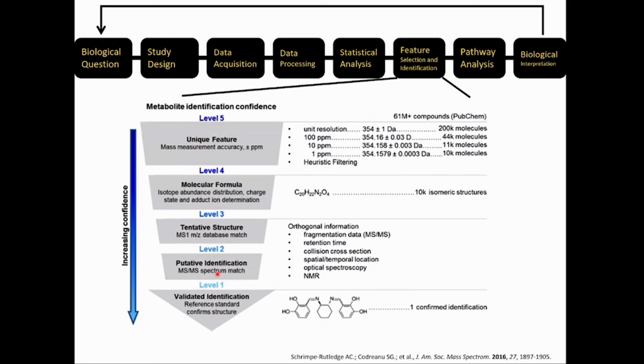I've seen where you can create these fragmentation energies, where you do different fragmentation to look at least at the species of a molecule and track it down. Exactly, when you're not getting a hit. You can do very sophisticated things. You can take a molecule, fragment it into chunks, and then depending on the type of instrument you have, take a fragment and fragment it further. MS to the n.